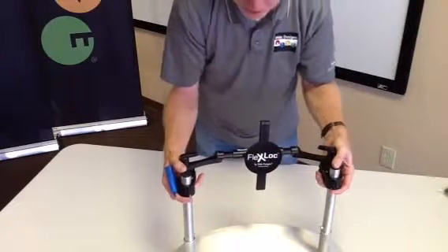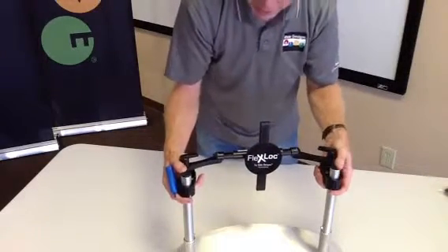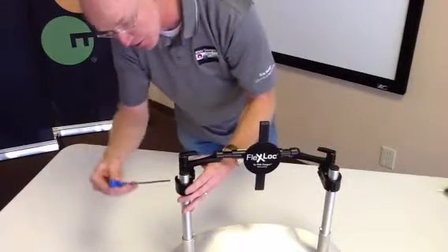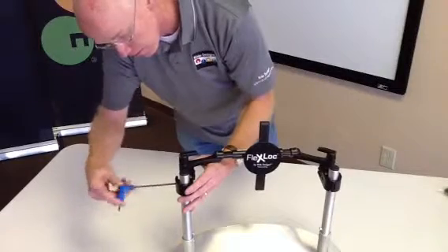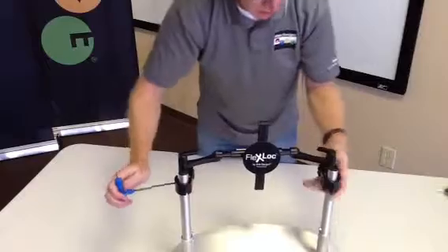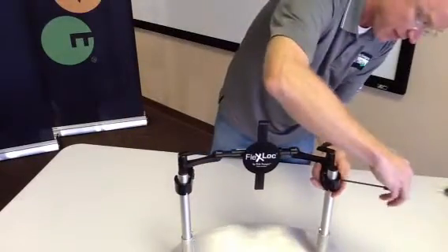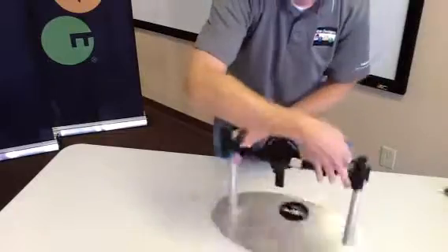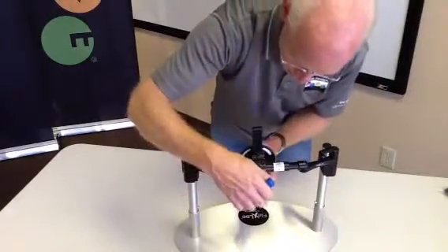If you find yourself running into interference on those back canes — rigidizer bar, armrest, whatever it may be — find the best position you can. Snug your clamps at that height, and then you'll be able to fine-tune the height from there.